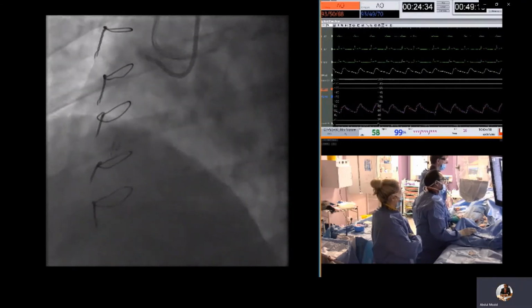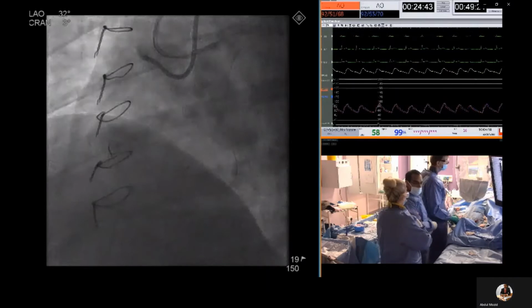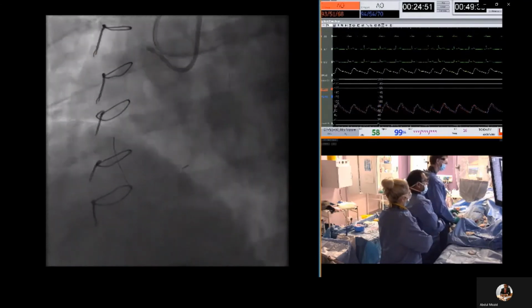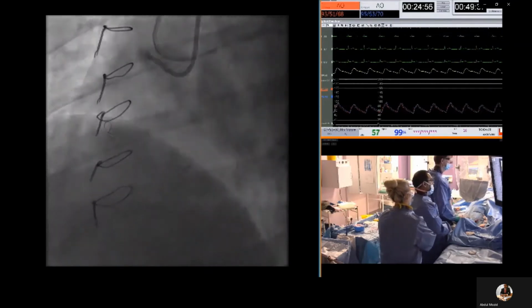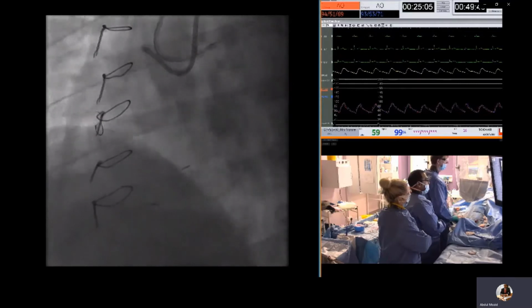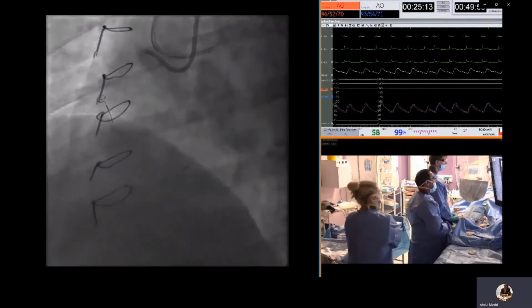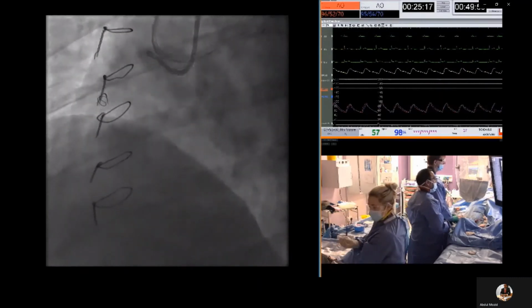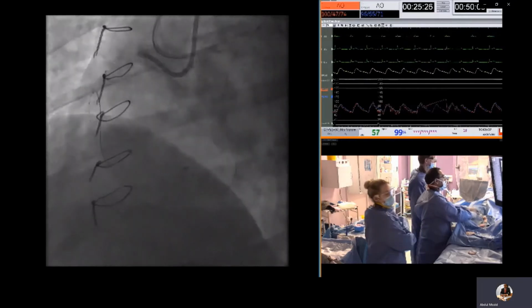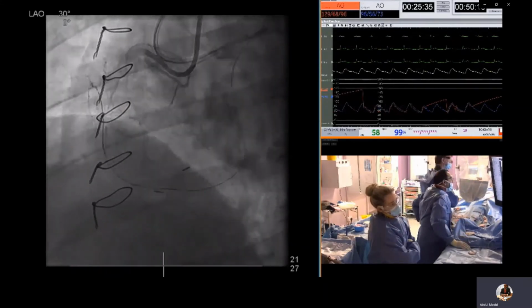So slowly but surely we made good progress up the right coronary artery. So this is the Pilot 200. Doing a good job. It's a very good knuckling wire. So we're now approaching the proximal RCA, and here there does appear to be some tortuosity in the vessel, and the microcatheter appears to be deviating to one side.